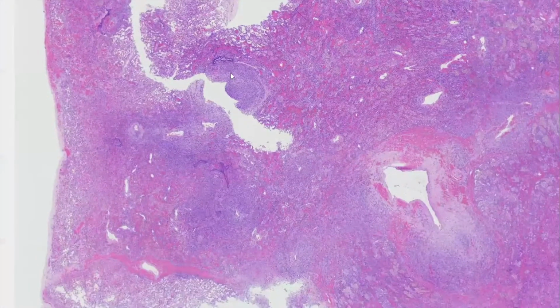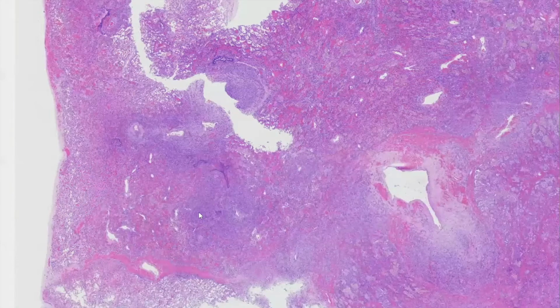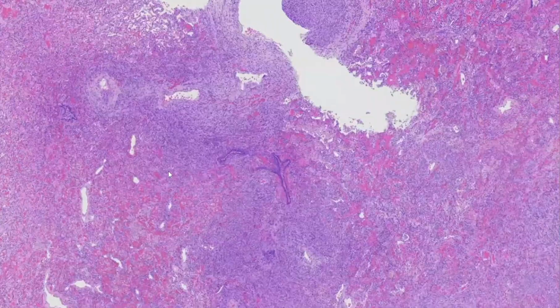You can see that there's this cellular area here that's really tracking along the bronchovascular bundle, so that we have an airway and a vessel here. We have this cellular proliferation around the bronchovascular bundles. It's also a bit in the interlobular septa.